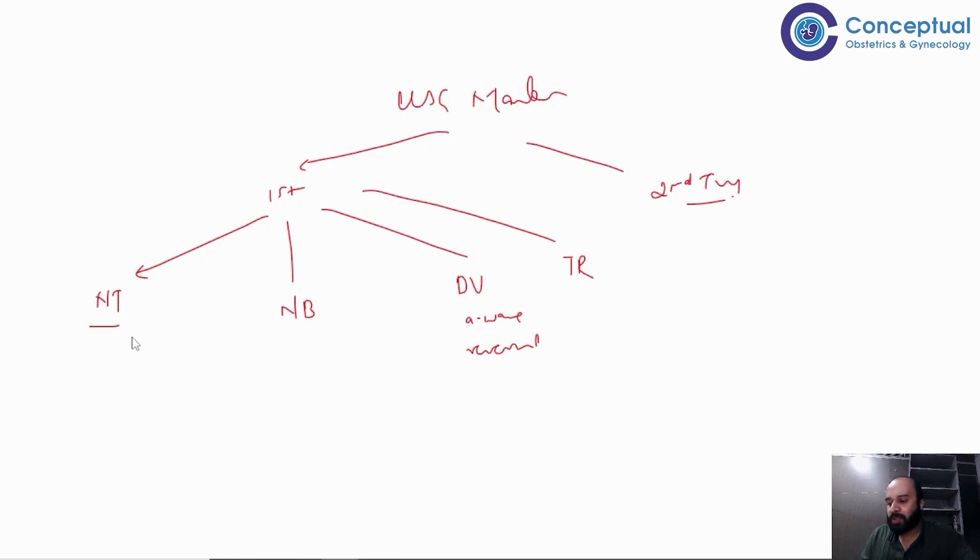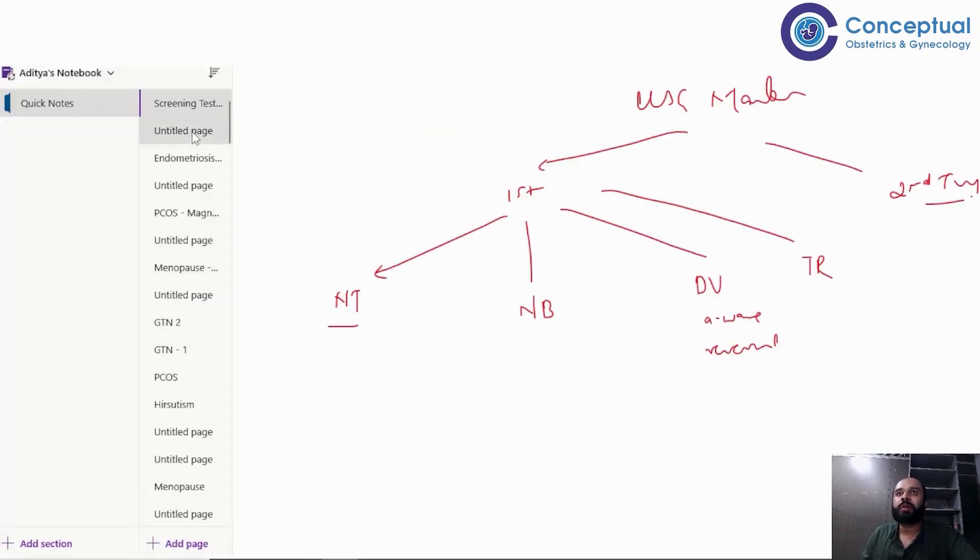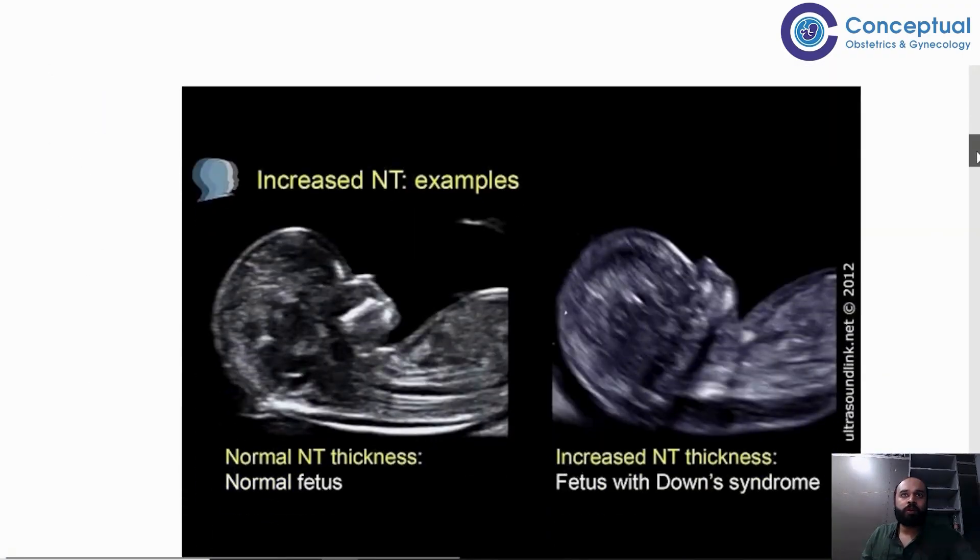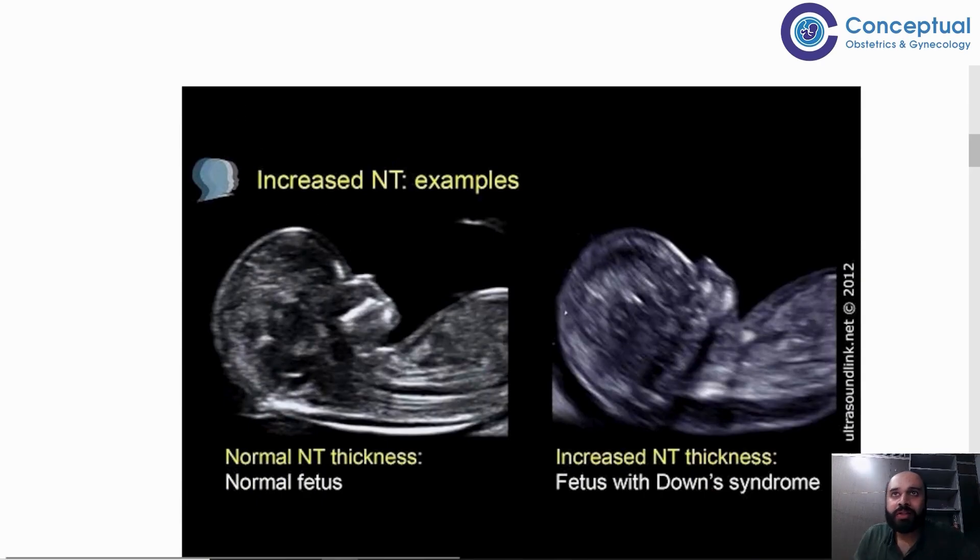Starting with nuchal translucency. What is nuchal translucency? First I am going to show through photos. This is what nuchal translucency looks like. You see that over here, this in red is your skin and this is your posterior wall of the body, the area between the skin.